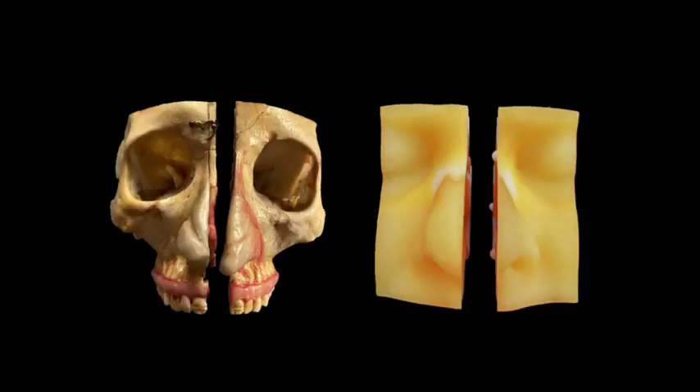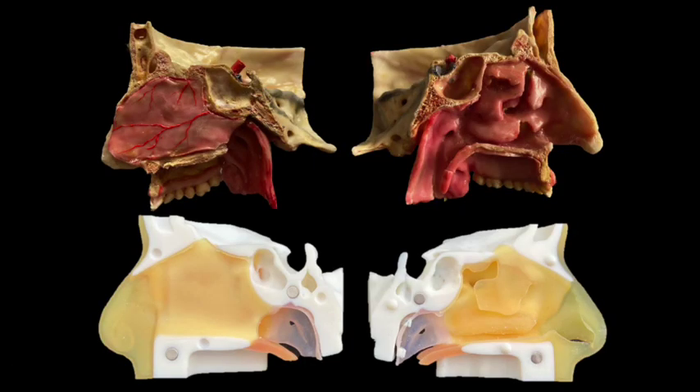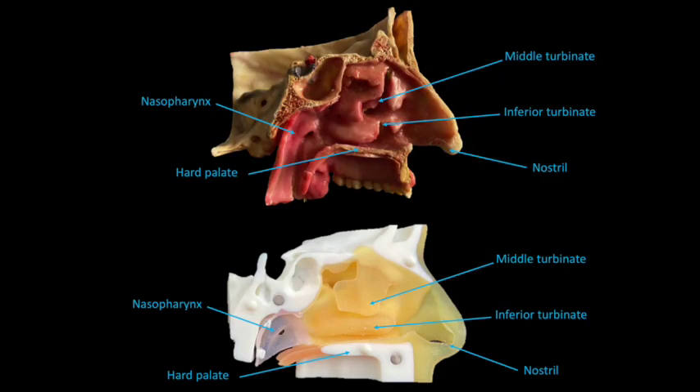This nasopharyngeal swab collection simulator splits in the parasagittal plane close to the septum in order to allow better visualization and understanding of nasal cavity anatomy. The model was designed to include main anatomic landmarks: facial skin, nasal bones including turbinates, hard palate, and nasopharynx.